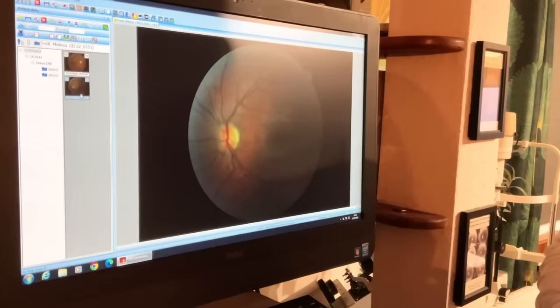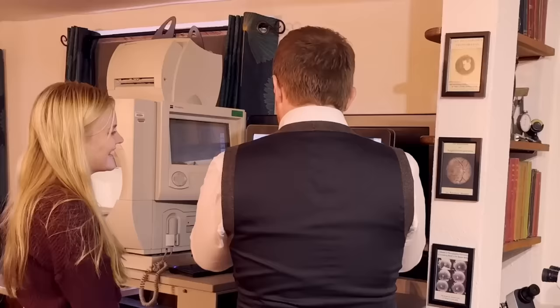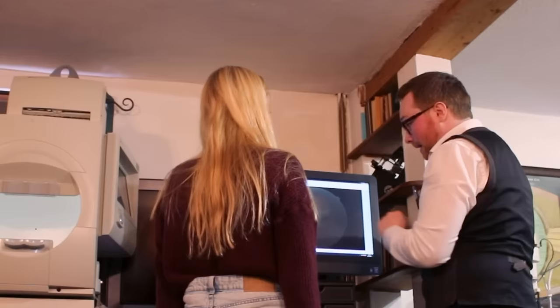So nice mirror images. That's part of the camera rather than your eye, not that sort of big button shape on the edge of your retina there. So yeah, lovely clear images, clear view in, clear view out. But as I say, what we'll now do is have a look at your eyes on the microscope, because I can look at the front surface of your eye, we can look at all the structures, the sort of clear optical structures, and then get a good view of the retina as well.